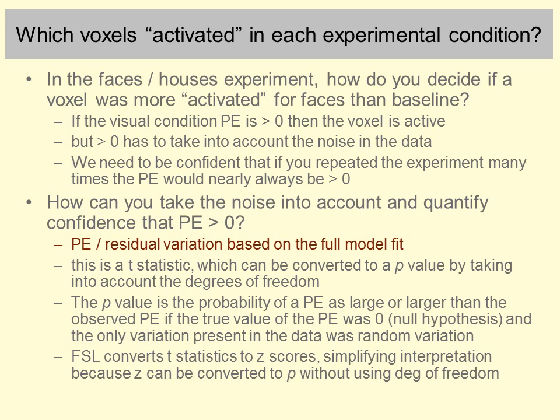That gives you an estimate of the unmodelled variation. And this makes it clear to you why it's really important to reduce the size of that residual error term by judiciously choosing pre-processing steps and also modelling as much variation as you can in the data, because then your one parameter estimate for your one particular regressor that you're really interested in, for example the faces regressor, is going to be larger relative to that error term if you make the error term smaller, isn't it?